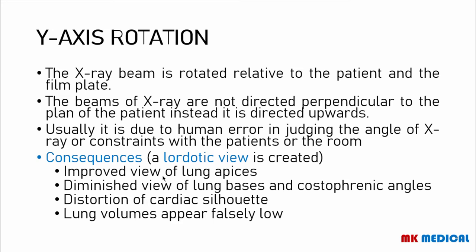I'll show you the picture of this and it will make much more sense. So it will mean that the x-rays are now entering into the body at an angle. They're not really entering at 90 degrees like they should normally enter. So the film that you're going to be creating when you have this y-axis rotation is noted as a lordotic view.